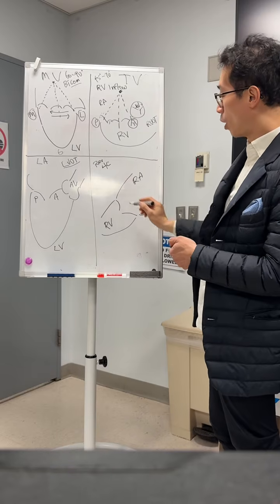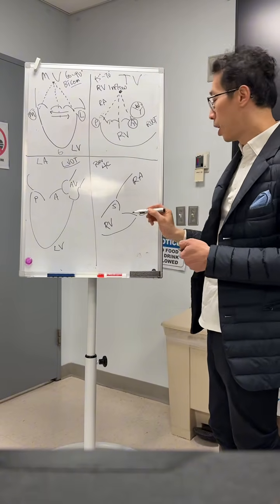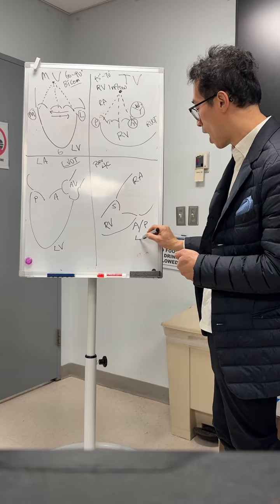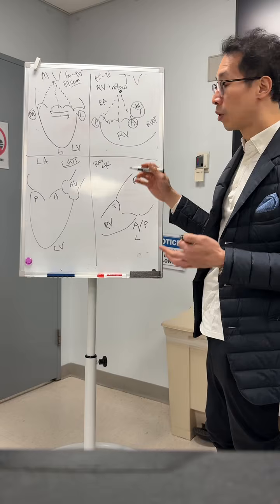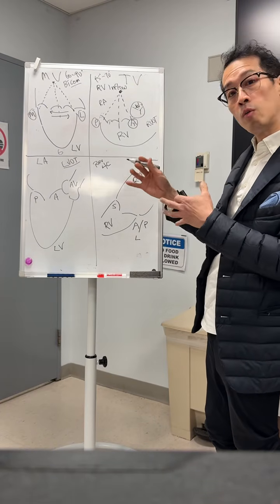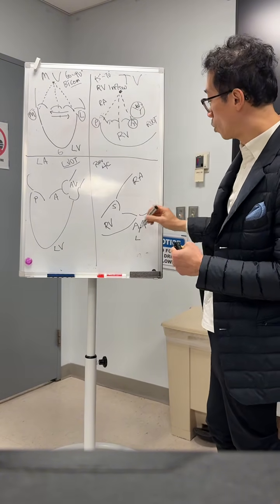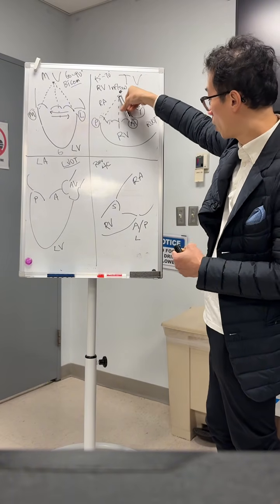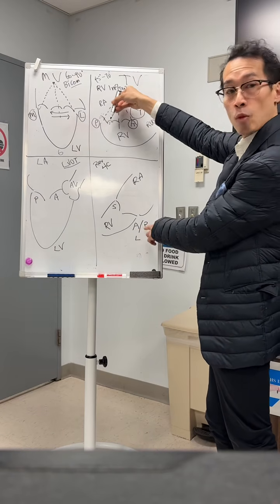So now, how do we know which leaflet is which? So this is always going to be septal, and then this one is going to be either anterior or posterior, or sometimes we even call it lateral. Okay, because sometimes there's a quadricuspid valve, so you want to be able to figure out what the lateral is actually, more A1 or A2, was A2 or P1, P2. So what I'm referring to is that why you do not know whether it's A or P is depending where your beam is located. So if your beam is more here, it's going to be more A, right? If it's going to be here, it's going to be more P.